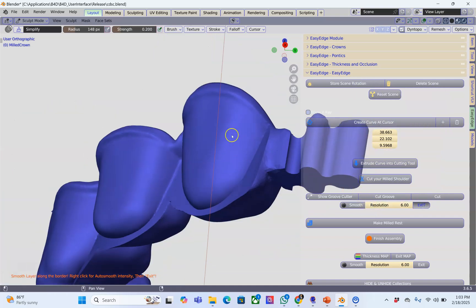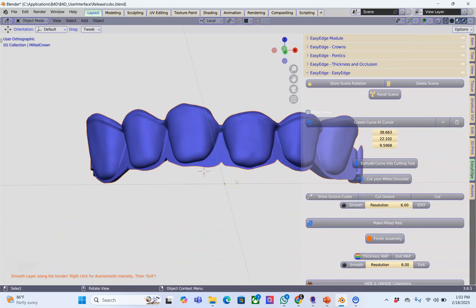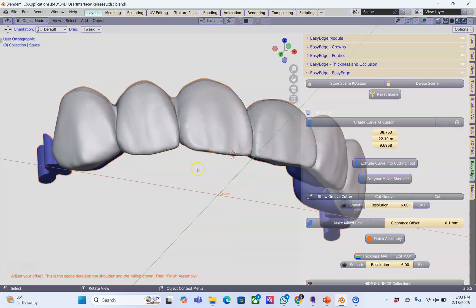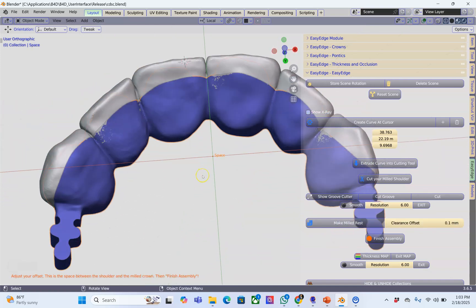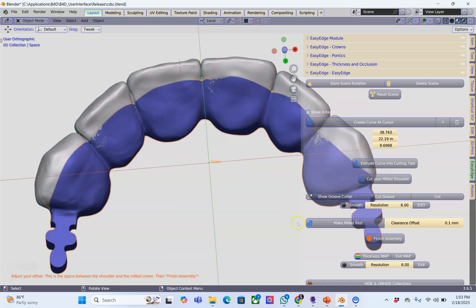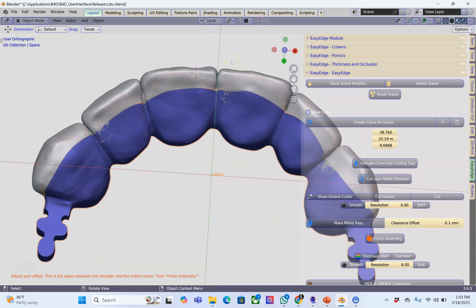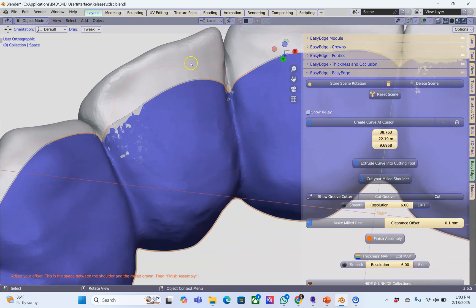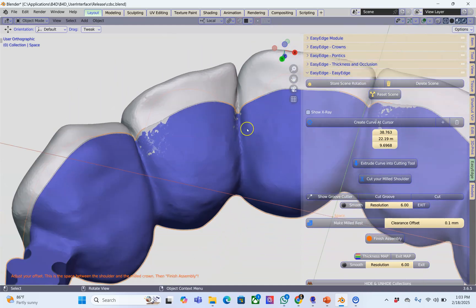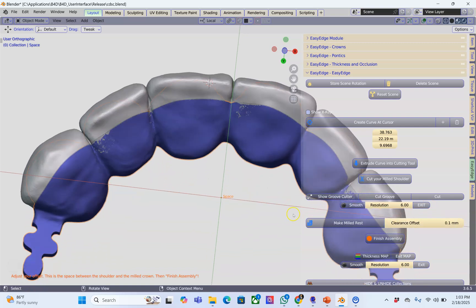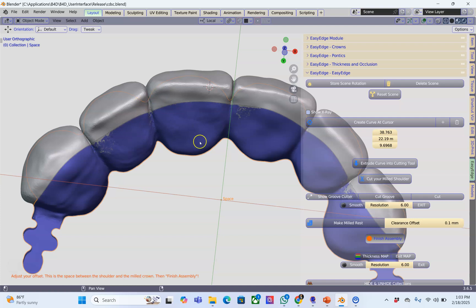Let's see the outcome. I'm going to exit my smoothing. Now we're going to make the milled rest. This is the milled rest and hopefully it's going to do what it needs to do. Here we've got an offset of 0.1. You may wonder what that is. The offset is the air space between the veneer and the other structure. You can set that. If it's too tight or too loose, this is where you're going to set it. Let's click on finish assembly.